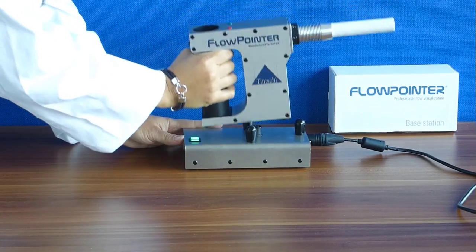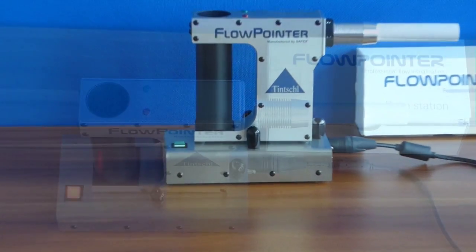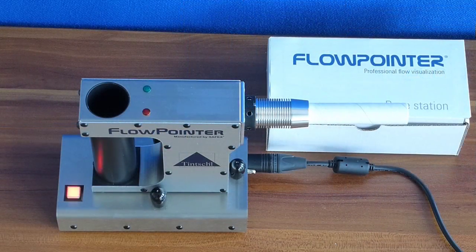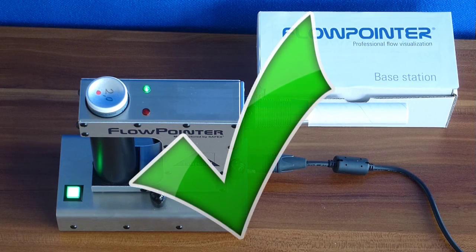Before you can use the flow pointer, you have to charge the mobile unit. The red blinking light indicates the heating process. When the green light is on, the flow pointer is ready to use.